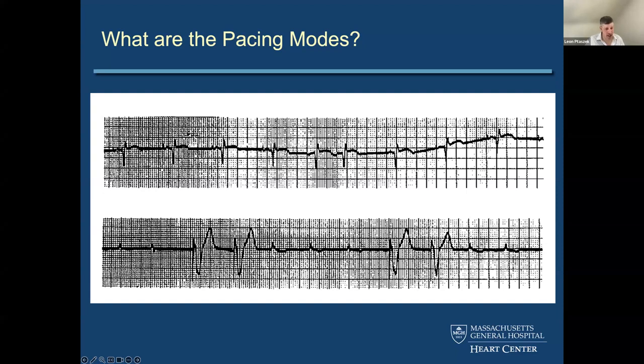So you have pacing, atrial signal followed by a native QRS, pacing, atrial signal followed by a native QRS, pacing, atrial signal followed by a native QRS, same thing, pacing, atrial signal followed by a native QRS. Here's a native P wave that comes in a little bit earlier. The cycle length here is a little bit shorter than that of the pacing cycle length and followed by the native QRS. Here's another beat that comes in a little bit earlier. This one I think would qualify as being a PAC, where you have a PR interval that's just a little bit longer, followed by a QRS.